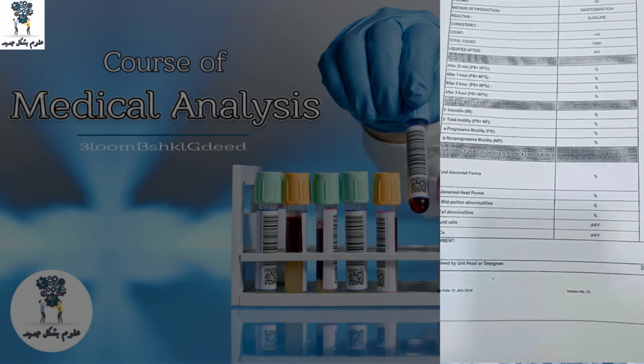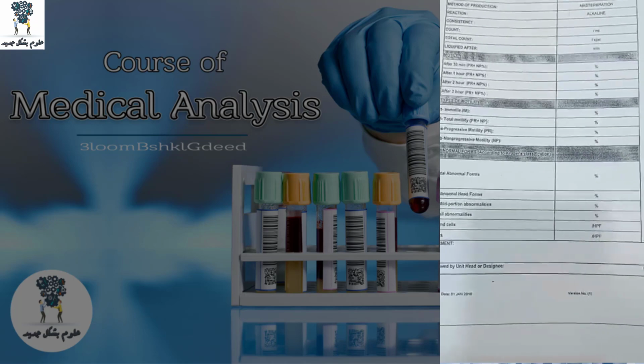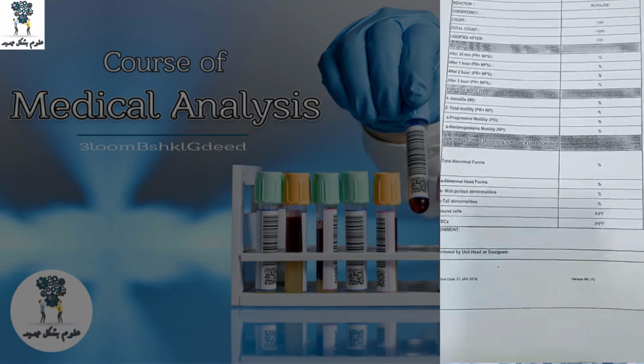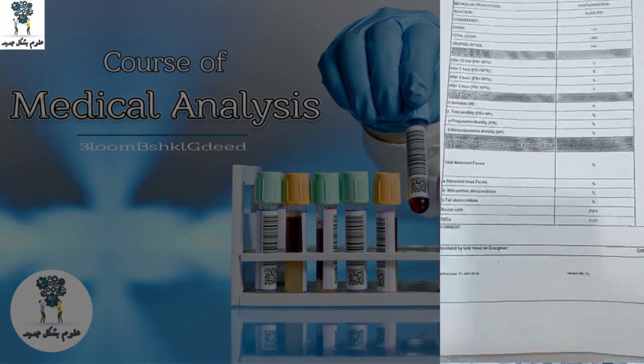Then we will make a dilution, multiply by the factor, then make the count. So take care when you make your calculation, it is very important. Then we will measure the motility.